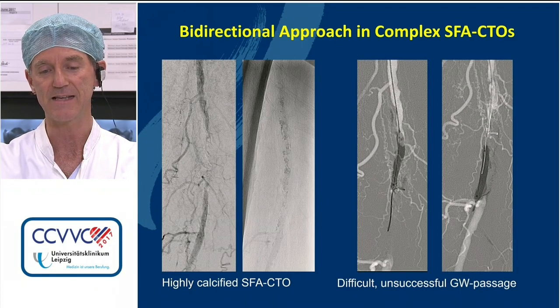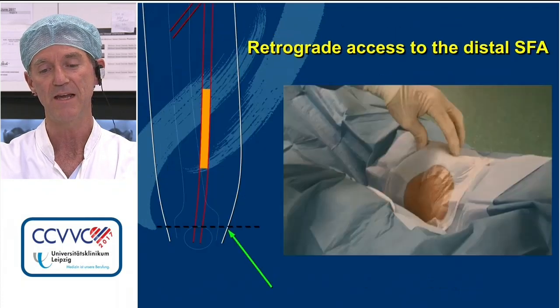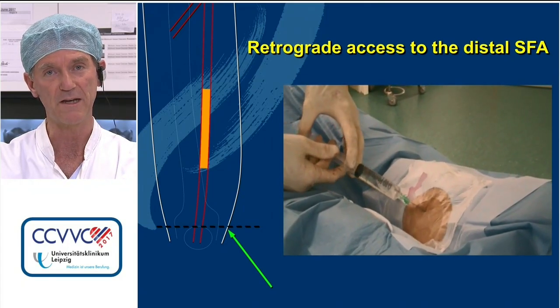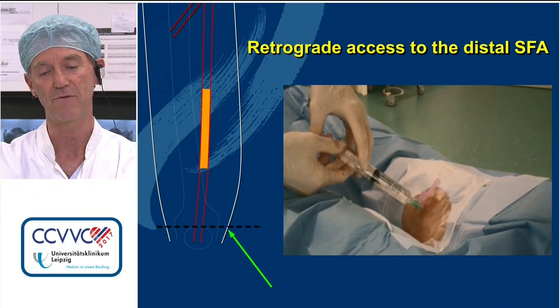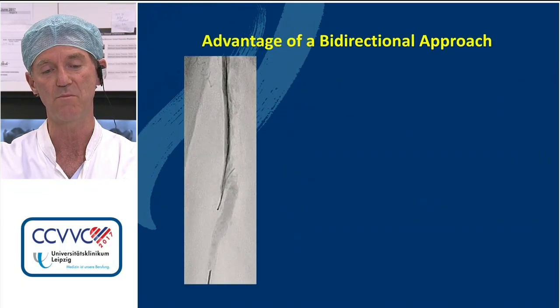In this case, we were not able to get the wire back into the true lumen distal. We stopped relatively early, not to destroy these collaterals distal to the occlusion. These wires are a little bit too low already in this area. When we cannot re-enter, we very quickly change to the retrograde approach — not the popliteal approach turning the patient — but we puncture here at the knee.